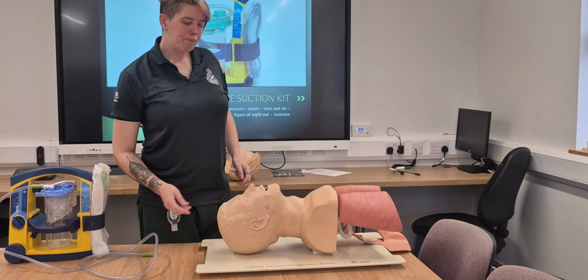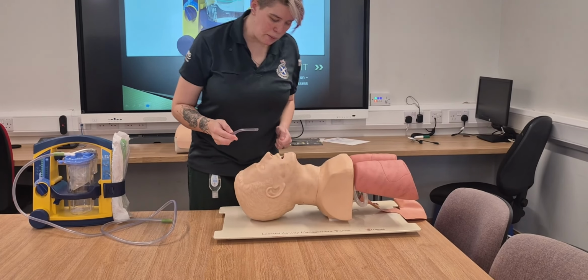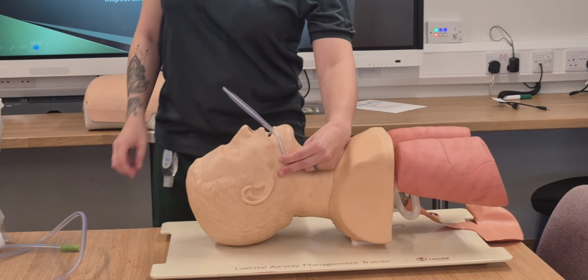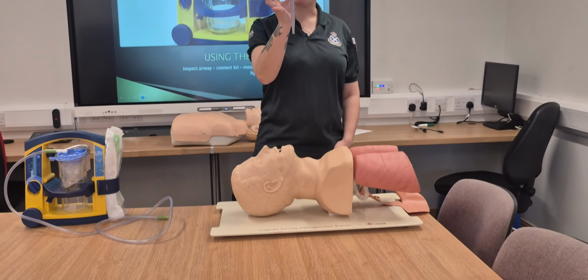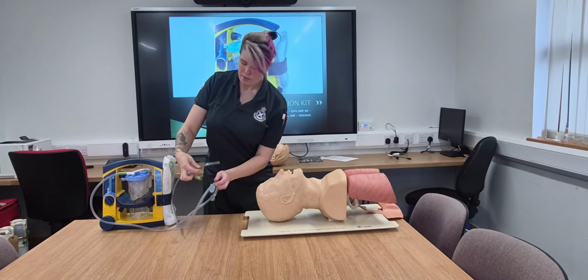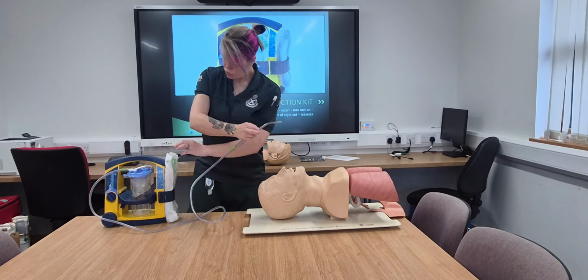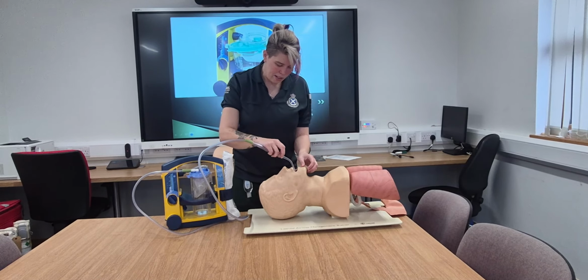How I'm going to do that? Firstly, measure. So I've got the end of my suction tube in here. I'm going to measure from the angle of the jaw here to the middle of the incisors. So what I'm going to do is pinch. The reason for that is so that I don't go any farther than that point. So make sure I've got that pinched. It's actually easier to make sure you've got all this connected up first. But once I've got that pinched and connected, I'm actually going to insert this first.